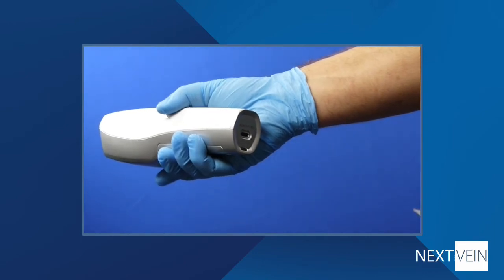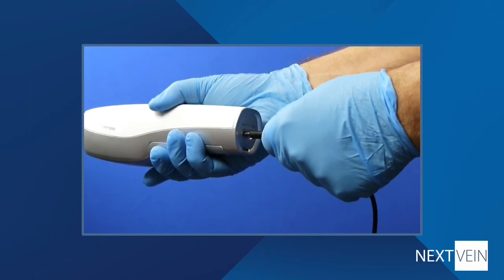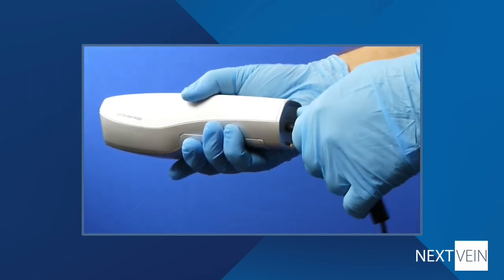When you're not using the device, it's a very good idea to keep it connected to a charger. This has two benefits: most importantly, it will be ready to use when you need it, but it will also help extend the battery lifetime.